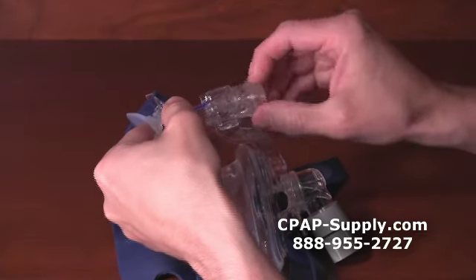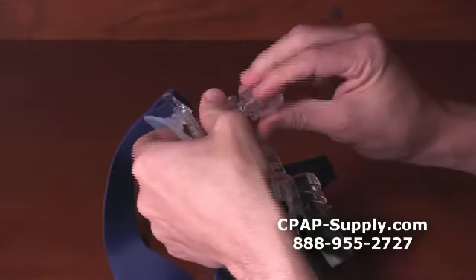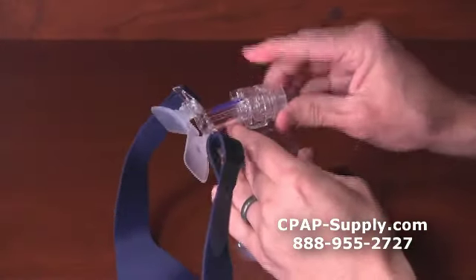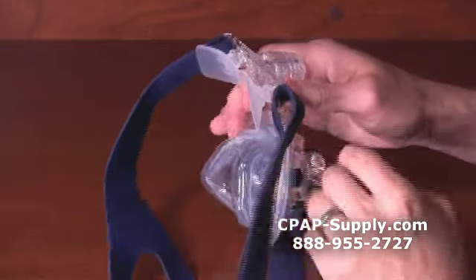If you keep rotating beyond the 24th position, the dial will loosen. This is how the horizontal forehead support is removed. The forehead support pad is removable and replaceable.